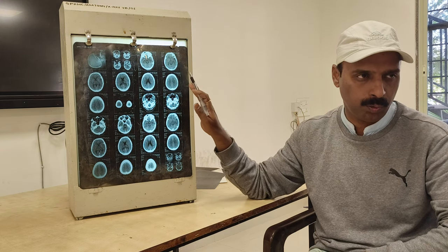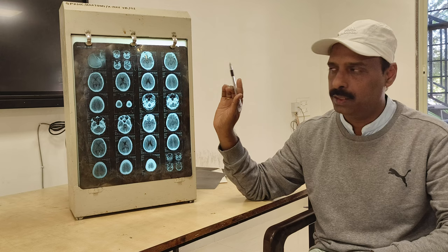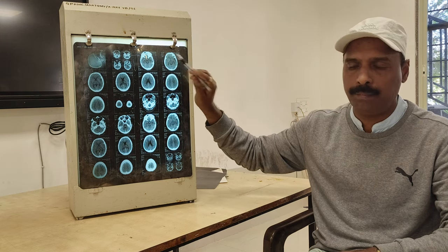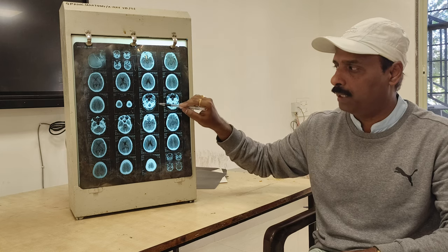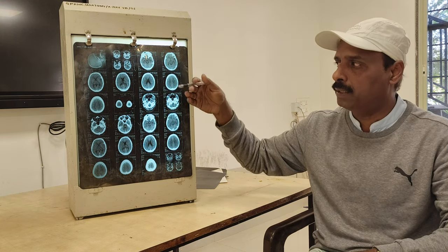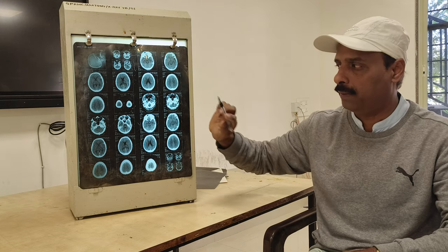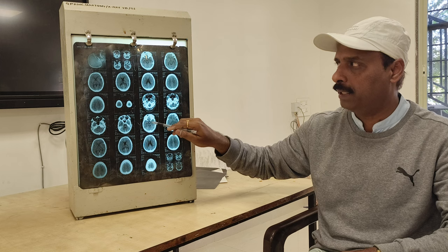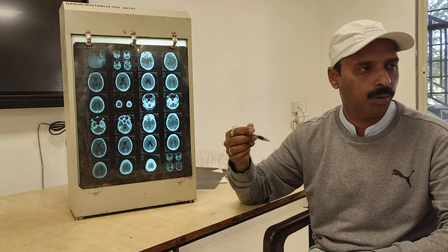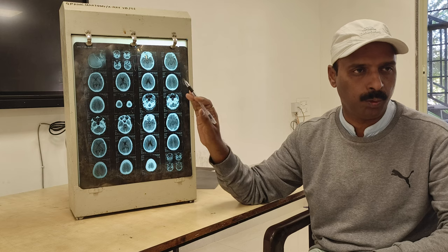So this is what you have to explain here: this X-ray, which we call a CT scan of brain. What we can see here are all the brain parts at different levels: ventricles, cerebrum, cerebellum, and all the bones, and we can see the foramen magnum. All the parts you study in the skull, those parts you ought to write, and you ought to see how the ventricle levels, the lateral ventricle, and the lower part of the brain at the base level are seen. That is seen in the different levels of the brain where we take the X-rays. That is what we call a CT scan of the brain, a computerized tomography.